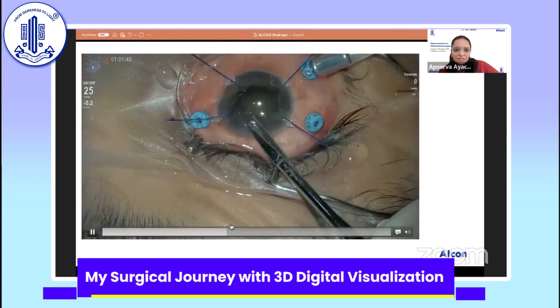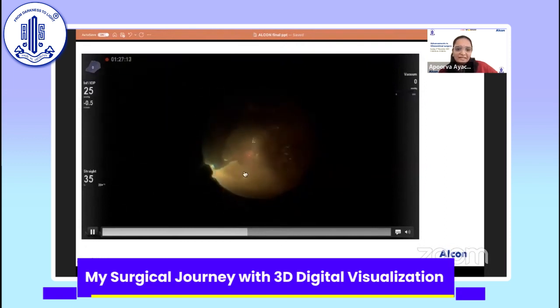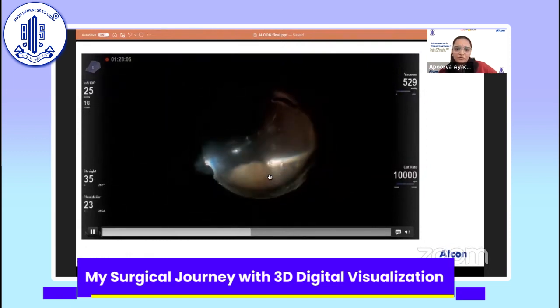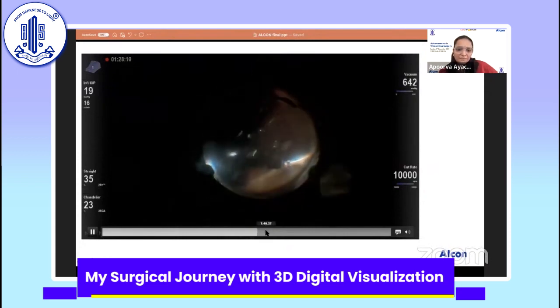But yeah, this patient had a foreign body in the periphery, and I took it out. And then after removing the membranes, you can see that the retina has become more pliant. And in hindsight, I felt that yes, the retina was very sclerotic and atrophic. This is the anterior flap of the retinectomy which I am excising.